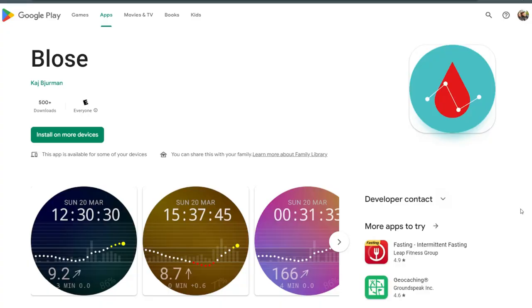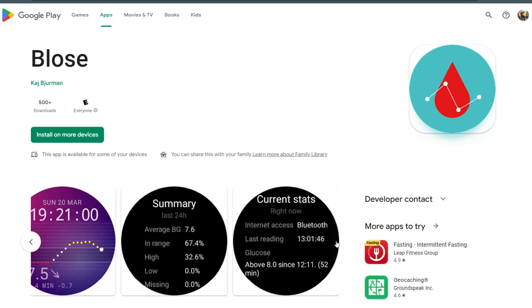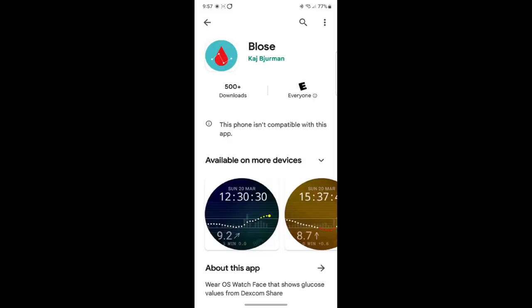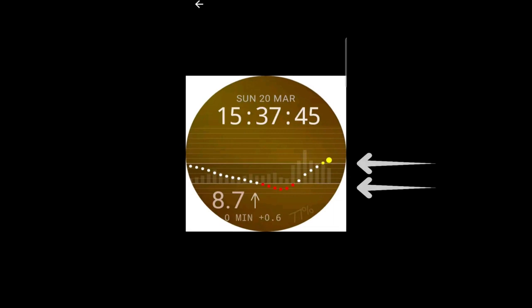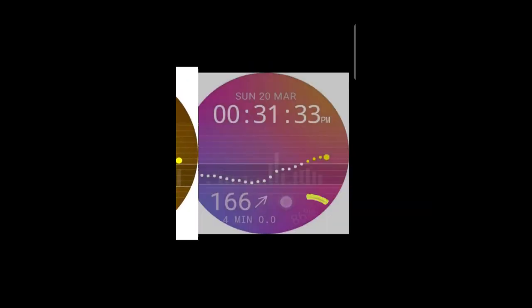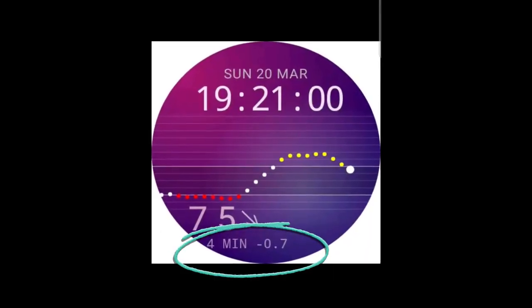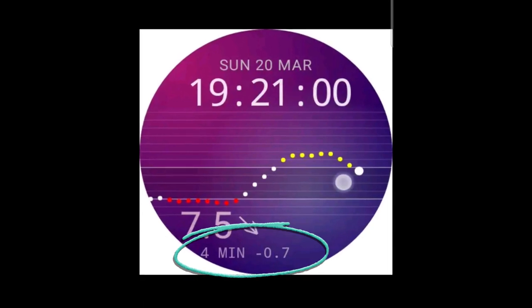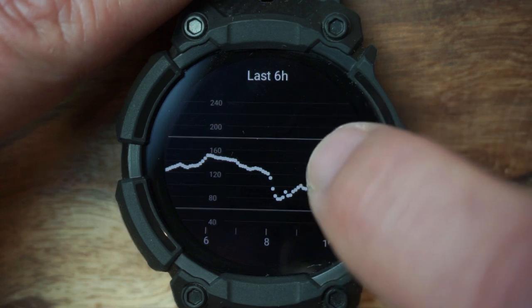I'd like to introduce you to the Blose app. This is a Wear OS watch face app that elegantly shows your glucose values utilizing the Dexcom Share, and it's pretty well polished. This watch face will provide you with super clean, easy-to-read glucose trends, glucose target ranges, your watch battery level, and minutes since last reading. There's even a double-tap feature that displays detailed graphs for 6, 12, and 24 hours.